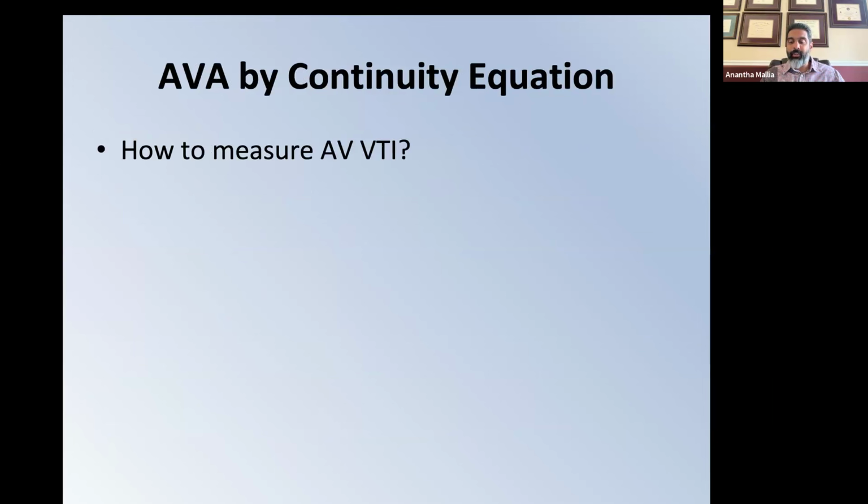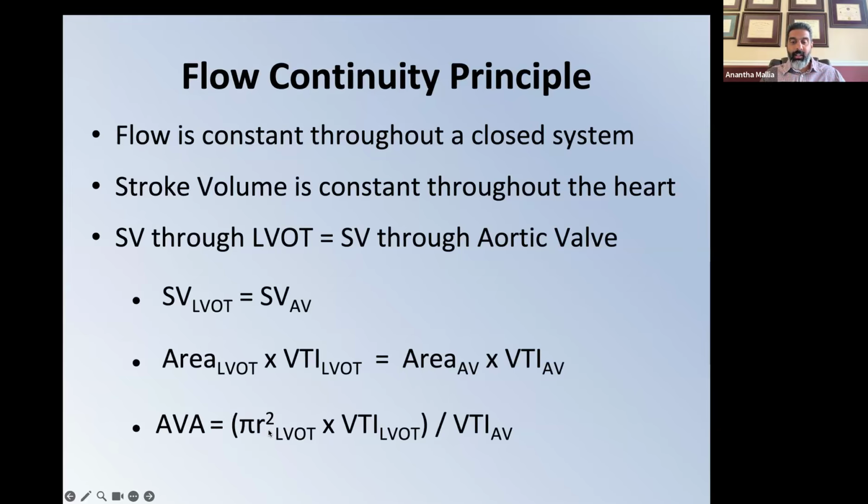The question is, how do you measure? So we know how to measure this. We know how to measure this. We've done this already when we talked about quantitative LV assessment. The question becomes, how do you measure the VTI at the aortic valve?